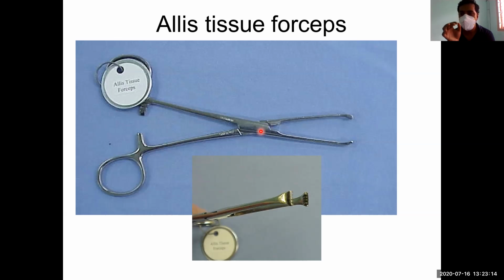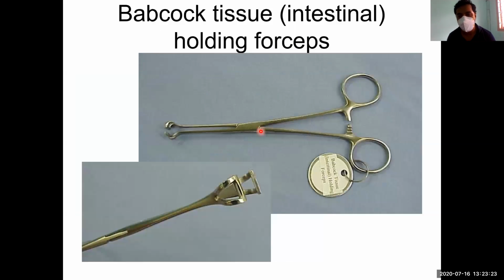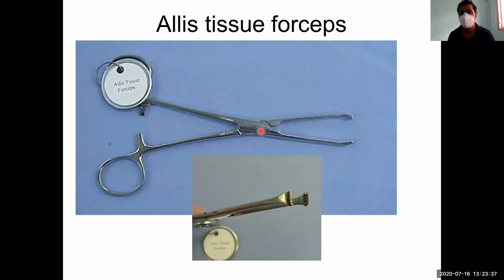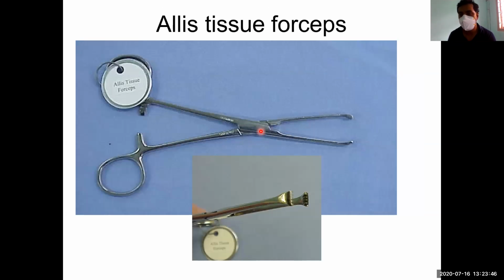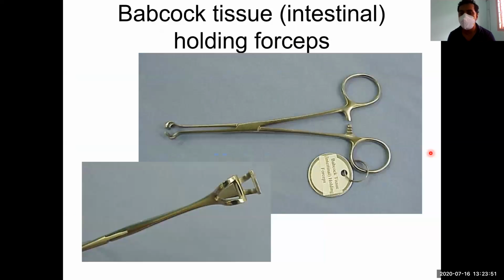Like how we do, we first hold the 2 parts of the bowel which we are going to cut and open, with the Allis or the Babcock. Any one we can use, and then in between these two we make our incisions, hold the edges and start the anastomosis. Okay, so we can use any one of them. Mostly we use the Allis, and for larger parts, like when we do anastomosis with the stomach, we generally use the Babcock. Even Allis also we use. Most commonly used instrument is the Allis. Babcock is generally used mostly in appendicectomy, and sometimes in various kinds of anastomosis.